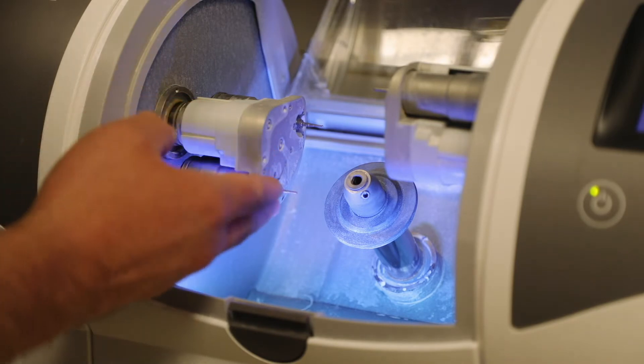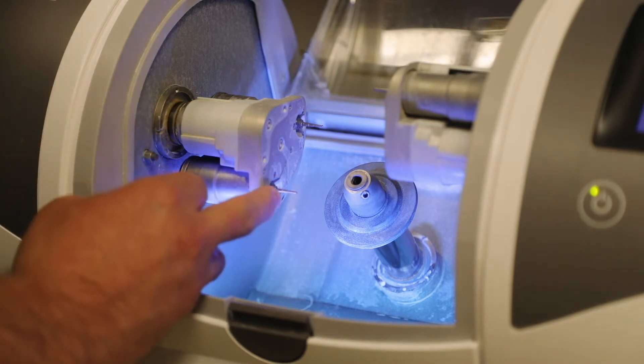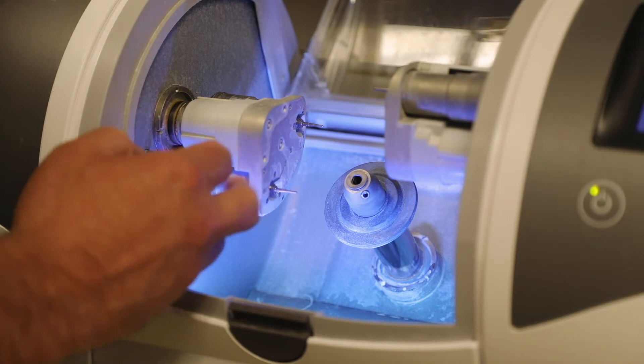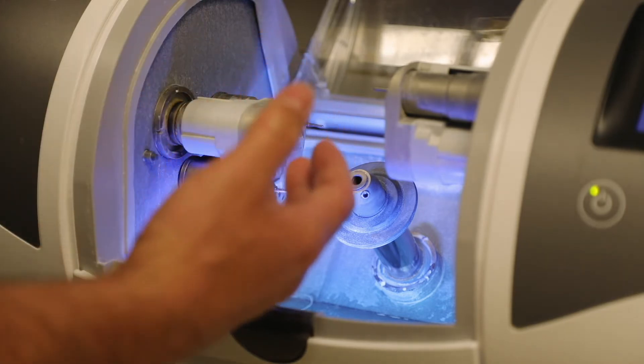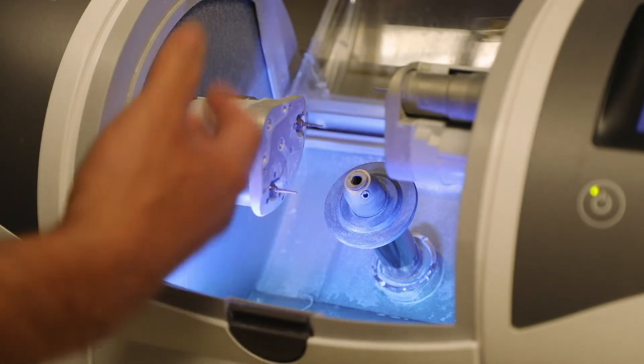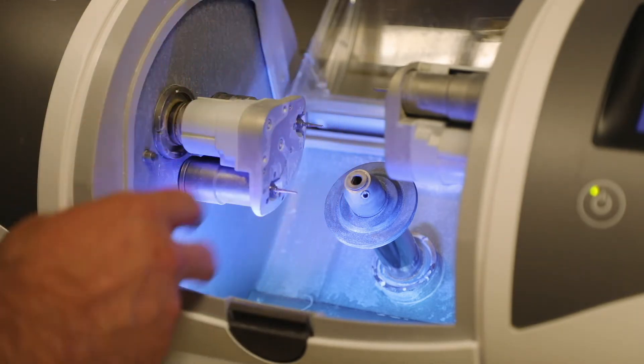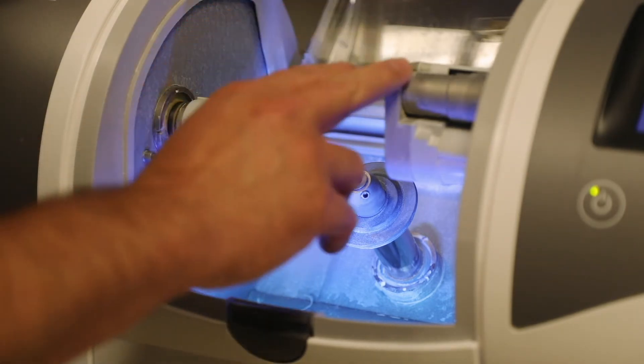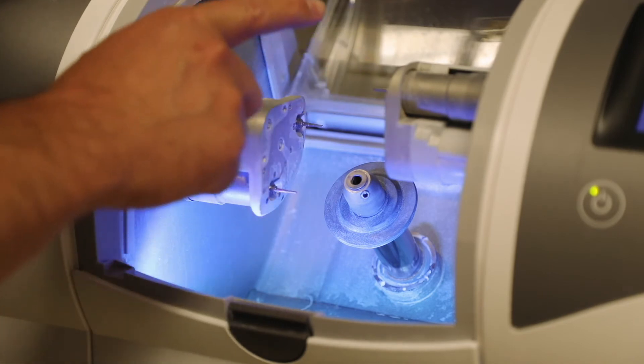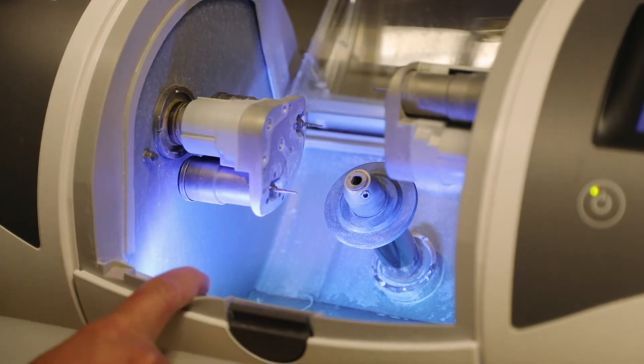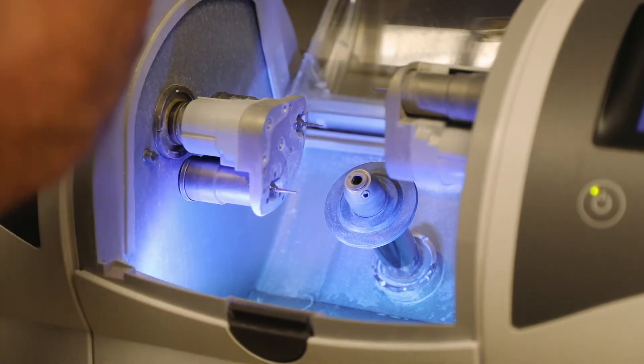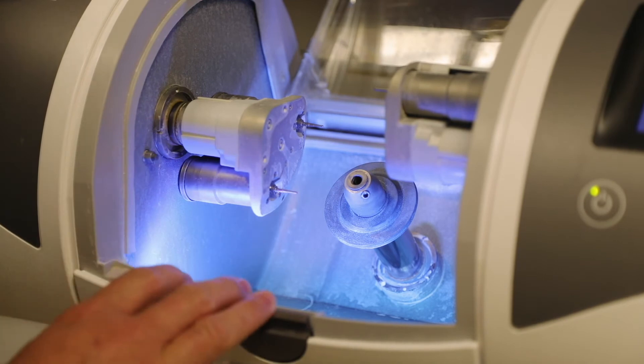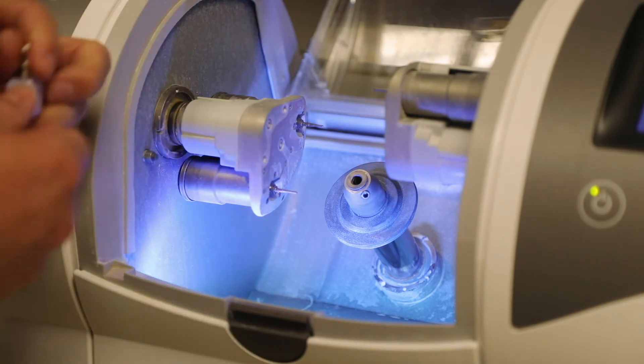And on the left side what we're looking at here is the step burrs. So these are the burrs that actually mill the intaglio surface of the crown or the inside of the crown. And then on the right side we have the cylindrical burrs that mill the external surface or the cameo surface of the crown.